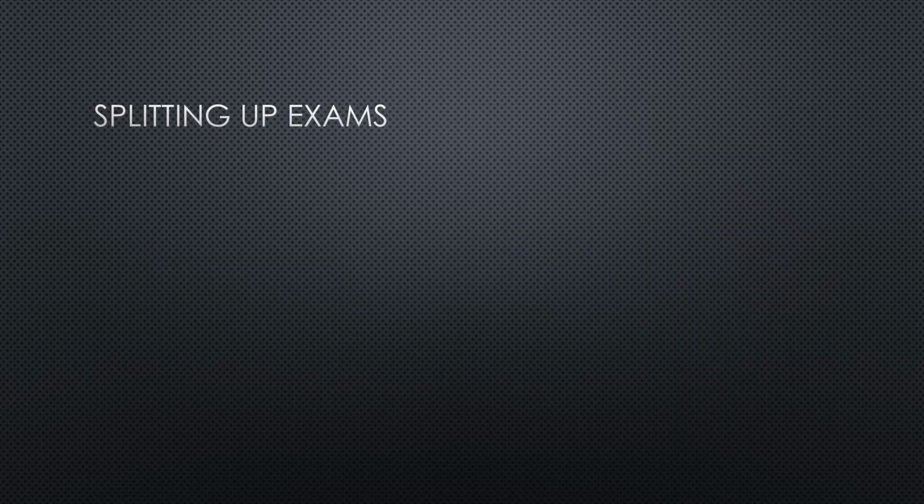Next thing to talk about is how to split up an exam. Now, again, like I said before, you should be changing presets every single time, so this should not happen, but it does happen occasionally. Another potential option would be you change presets but you hit the wrong preset.